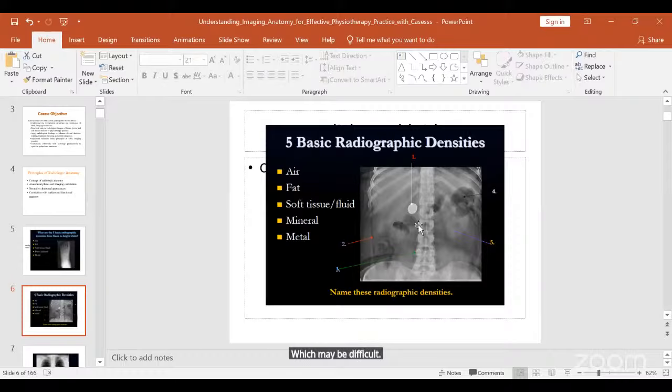But I want you guys. That's just in the soft tissue. Kidney, sir. Kidney. Good. I'm very happy. Why were you able to pick that as a kidney? How were you able to pick that as a kidney? That's the anatomical region where the kidney is. And because it was just pointed out, that was why you guys presume it's a kidney. And it is on both sides, posterior aspect of the low back. Let me give you the trick to identifying the kidney.